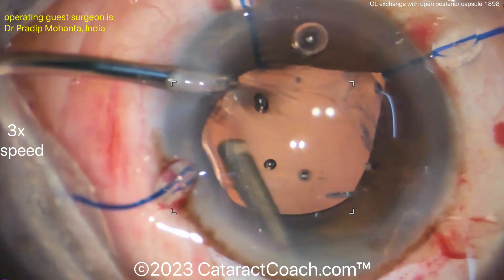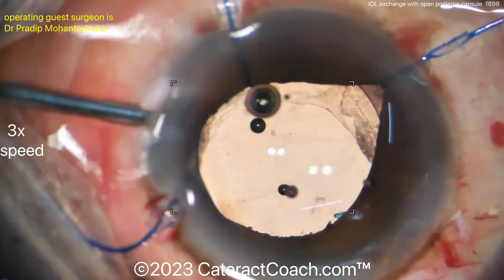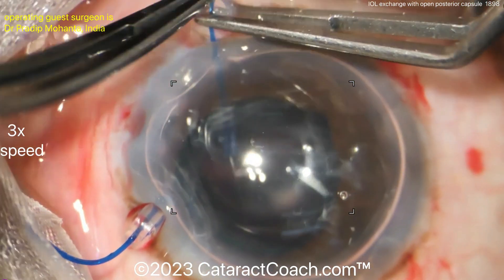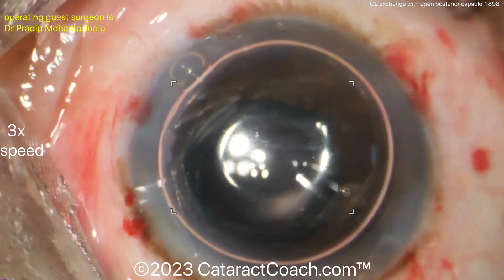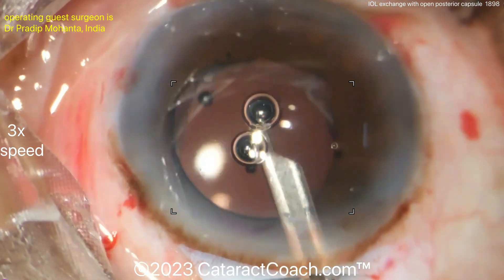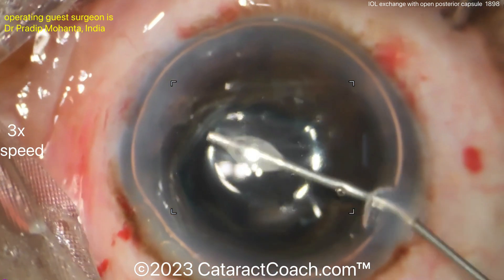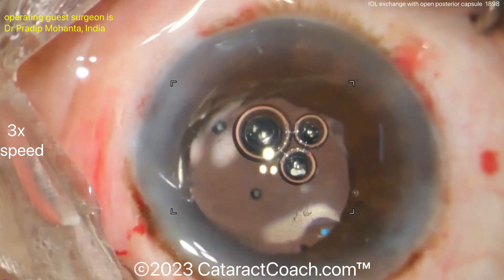In general, IOL exchanges are not preferred in patients who've already had a YAG capsulotomy or have an open posterior capsule — but sometimes you have to do it, and you can achieve a very nice result. The air bubble technique confirms the anterior chamber is maintained with a nice deep chamber and no vitreous prolapse. The large incision deserves a suture. An air bubble placed in the eye will resolve over a day or two. A little more triamcinolone is added just to be sure.